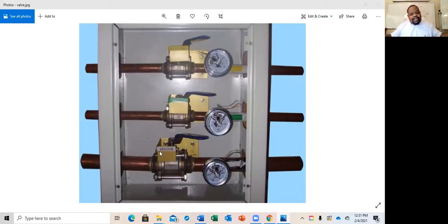There's a vacuum line that is a negative force that constantly allows you to suction a patient. If I suction you, right? You cough up a loogie in your mouth. They have a little wand called a yanker, or we can use a suction catheter that will actually go down into the trachea, right? We have a catheter, which you learn in 220, how to suction. You'll take the catheter and feed it all the way down into the trachea, right? And then suck that stuff out of there that the patient cannot cough up, okay?